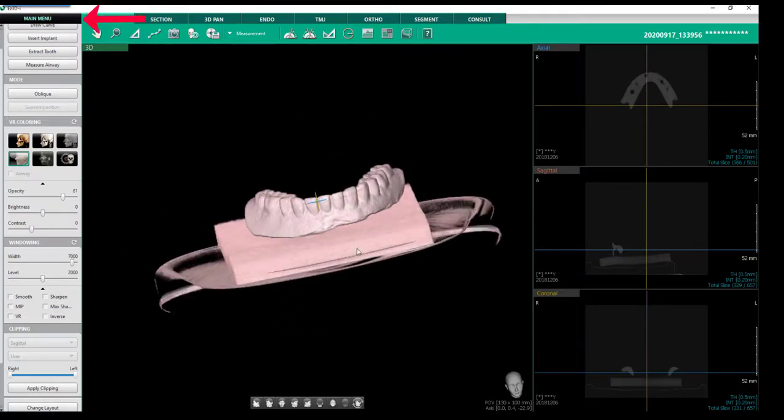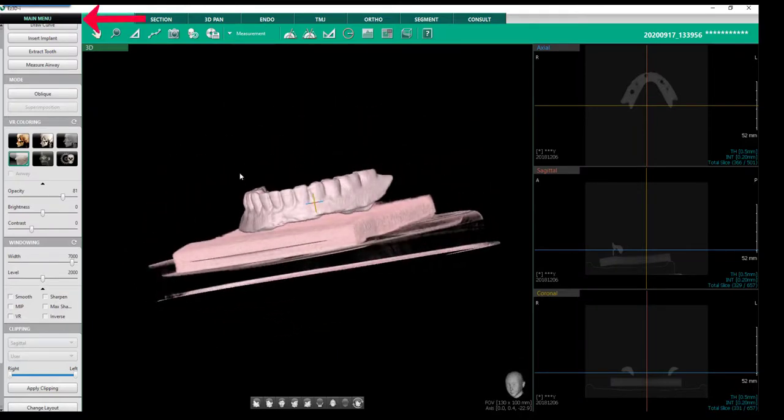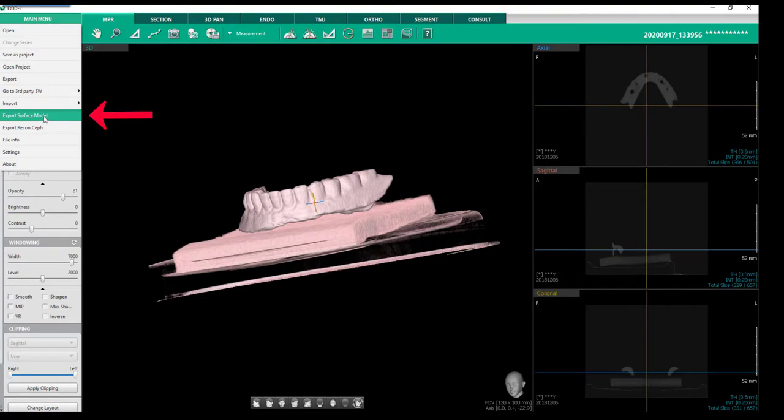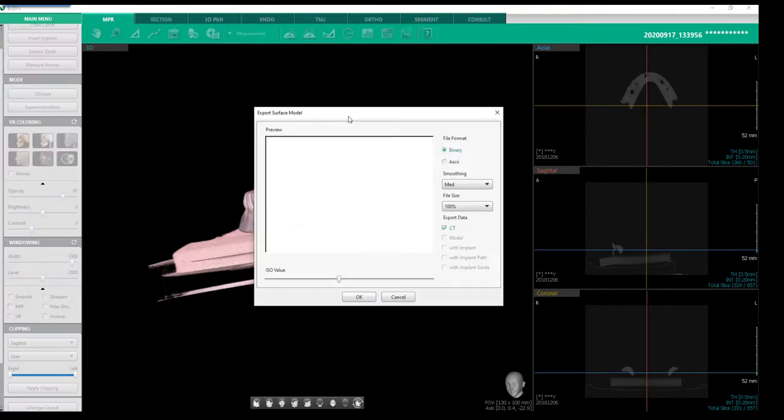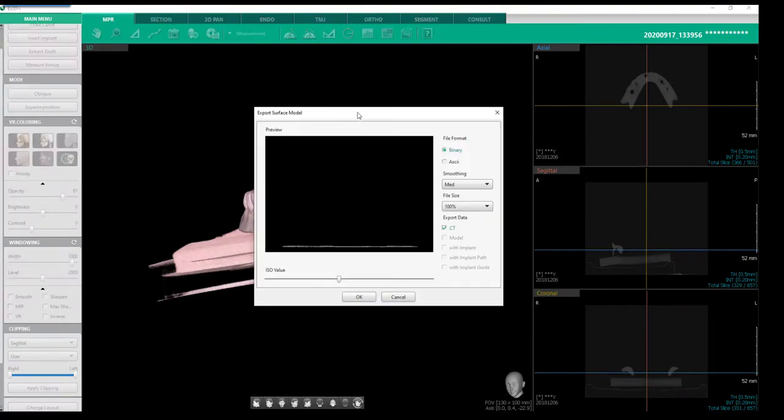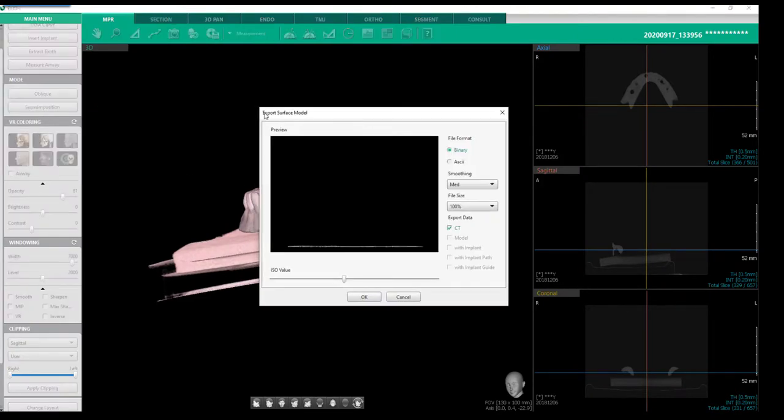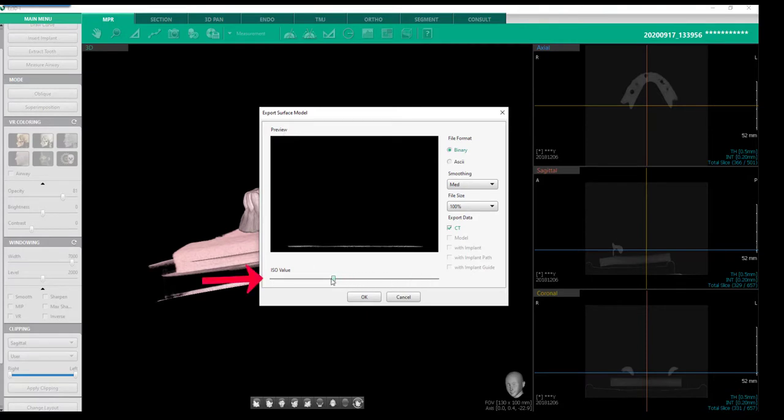Exporting as an STL file. Select Main Menu, followed by Export Surface Model. Next, we will want to adjust the ISO value to better visualize the object.